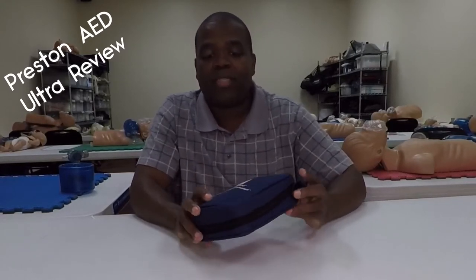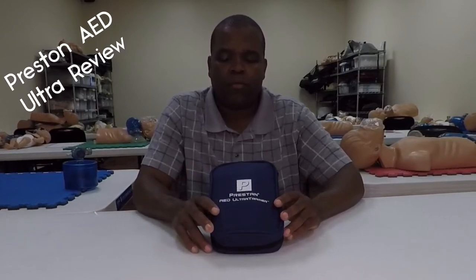What we're going to be checking out today is the Prestan AED Ultra Trainer. This is a smaller trainer compared to the other Prestan trainer on the market. We got a chance to look — it was running about $99 to $100, anywhere from that $99 up to about $110 as far as this trainer goes. It has a couple of features that I really like, so let's just dive right into it.